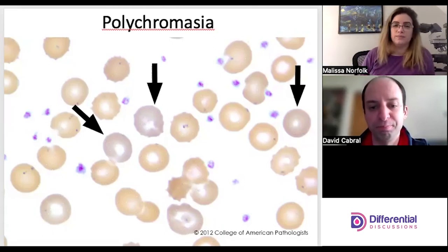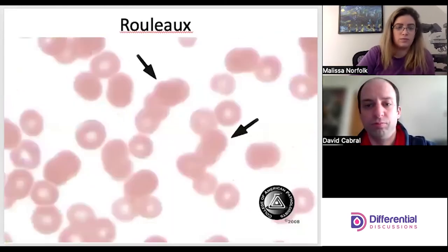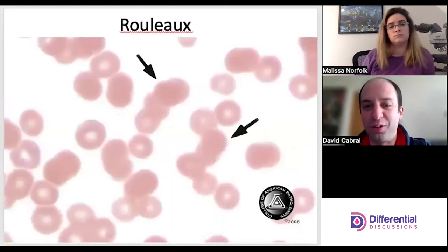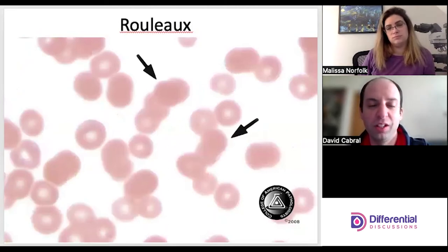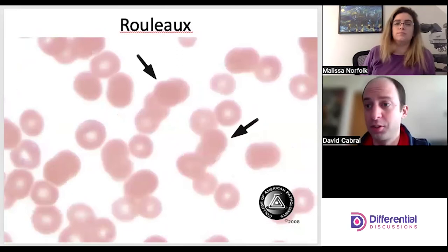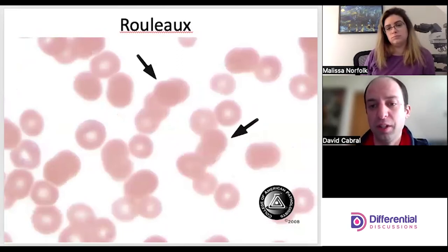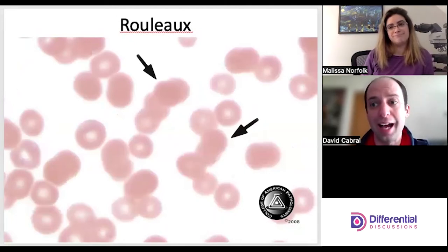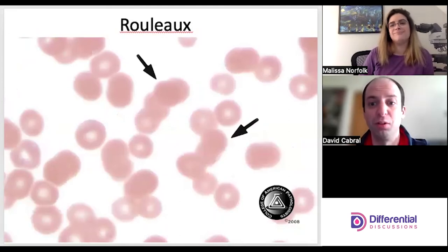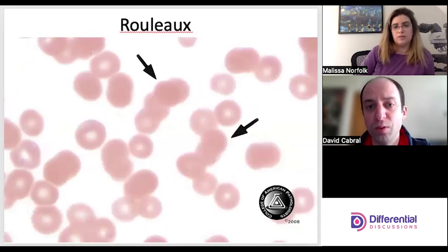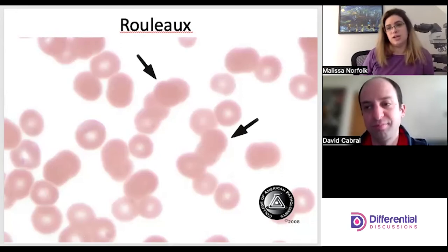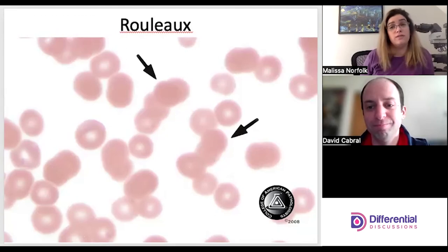Rouleaux — stack of dimes, pretty self-explanatory. One pitfall is that if you're in the wrong area of the slide you can see artifact that appears to be rouleaux. This is caused by a buildup of protein, which is different from agglutination, which is antigen-antibody interaction — you're telling the physician two very different things when you call one versus the other.